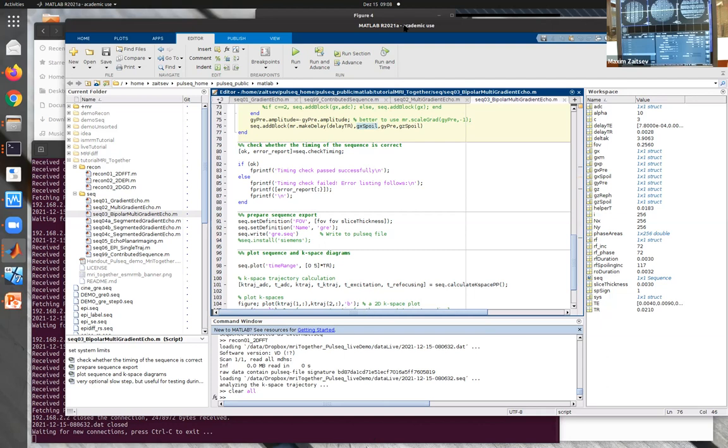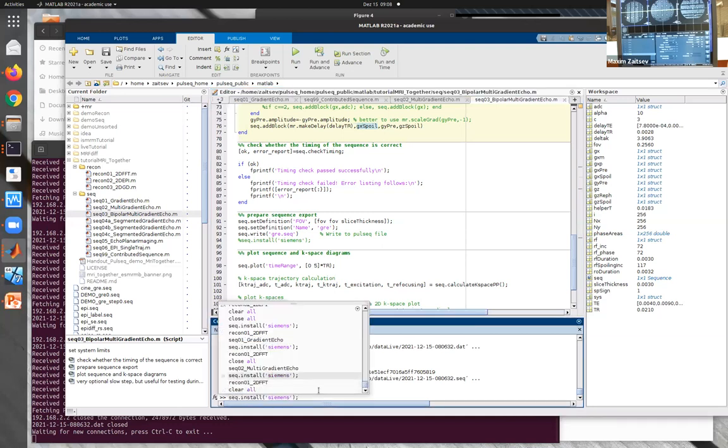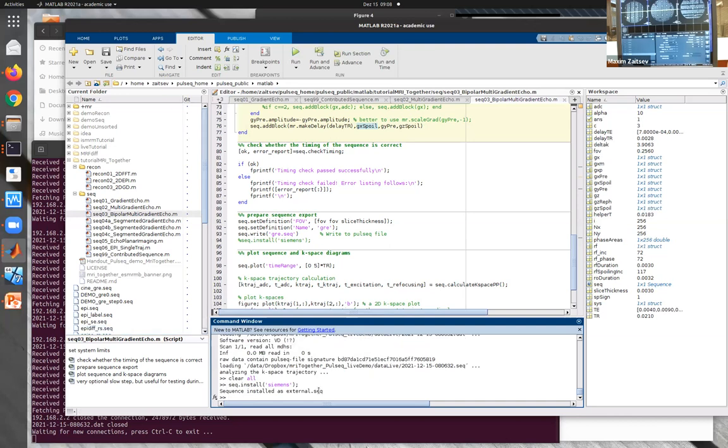Okay, so we are slightly over time, and I was told that the scanner will be available for the next 10-15 minutes, and this is totally fine. What I wanted to show you now: we generate a sequence, and we skip the checking steps, just install it on the Siemens scanner and run it, so it runs again.